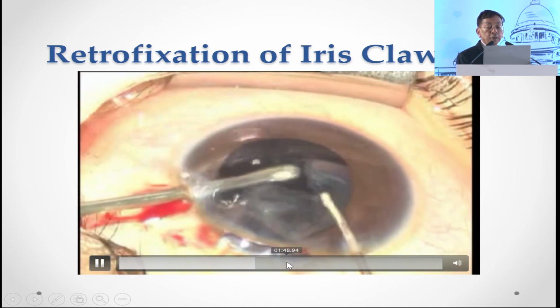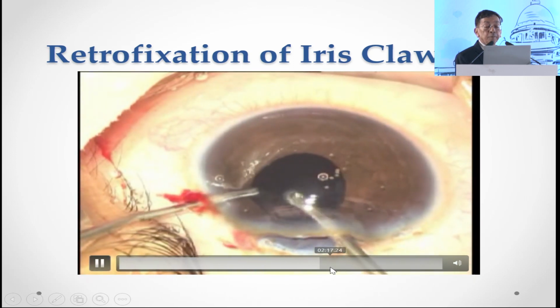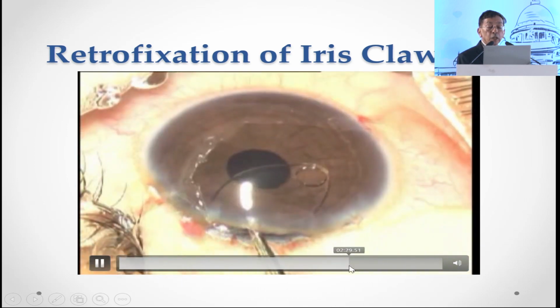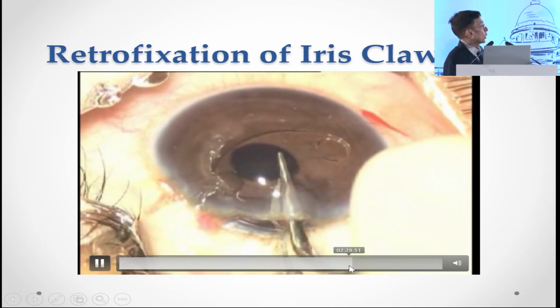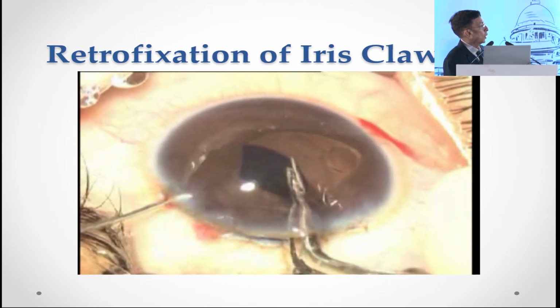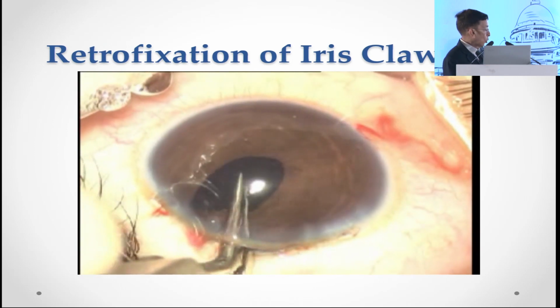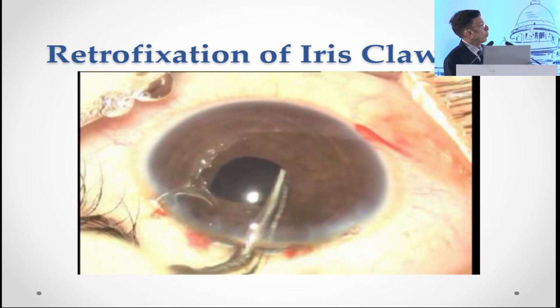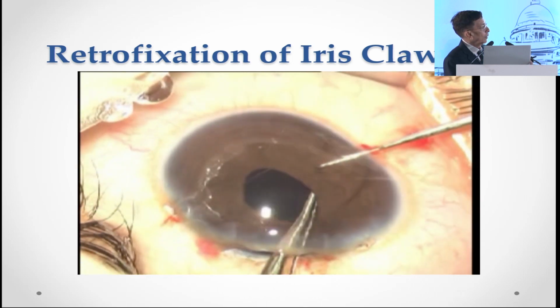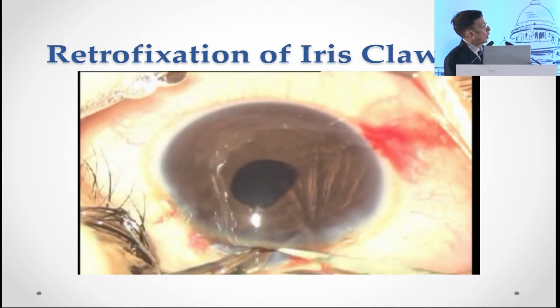The lensectomy is done. I will show you the steps of the enclavation. This is important, friends: this is how simple it is to put the iris claw. Another important thing is holding the iris claw steady from this point, because once you claw, it will give a pressure on the forceps, and once it is clawed, you can see it is central.